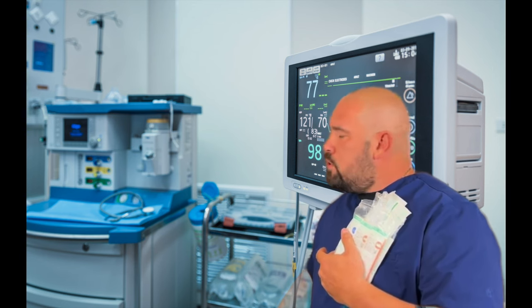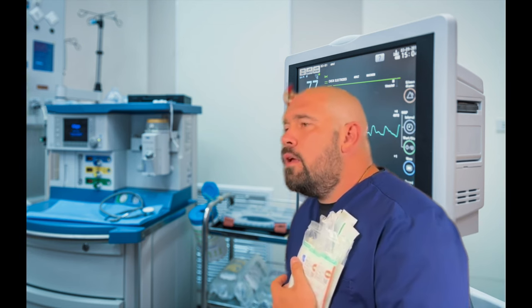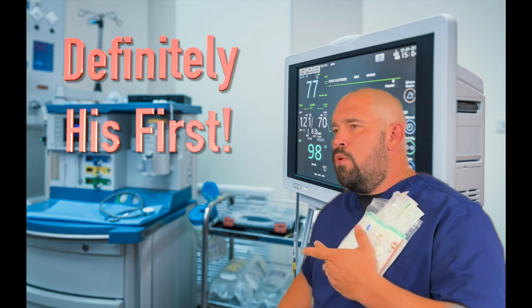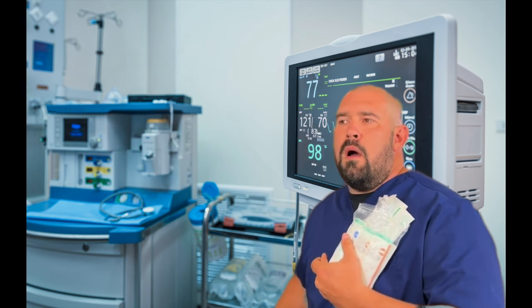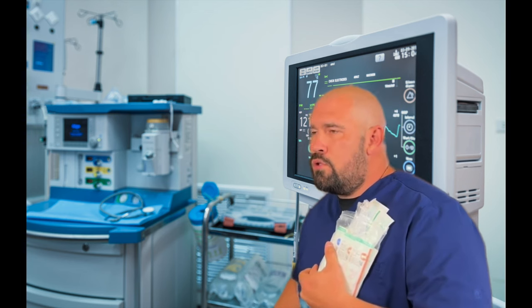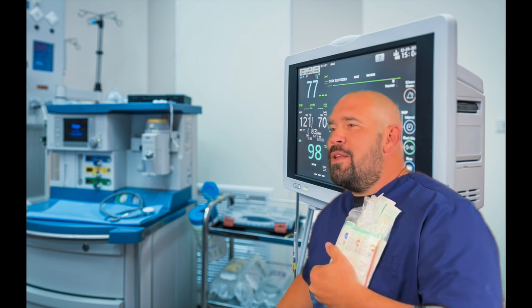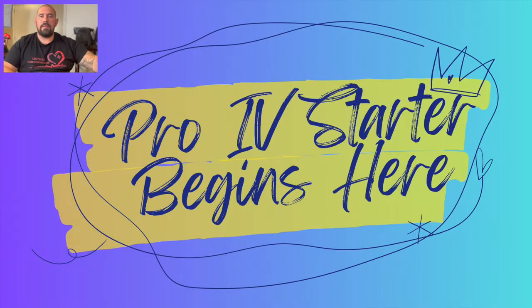Hello Mr. Smith, my name is Larry. I'm here to start your IV today. I just wanted to tell you before I did it — is this my first IV? No, this is not my first IV on a real person. I've done this before, many times. I've always done really good, so today's not going to be any different. Let's go ahead and get started and see if we can get you fixed up soon.